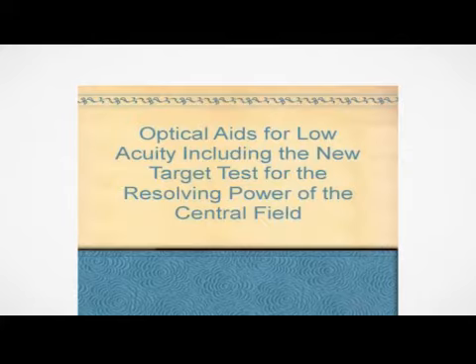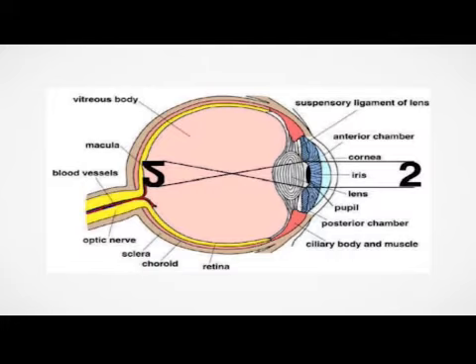Optical aids can greatly benefit some students with low vision. It is important that low vision aids are prescribed by qualified eye care practitioners. One optical aid cannot fulfill all low vision needs, and students should be assisted by trained personnel to experiment with a range of prescribed aids to evaluate their suitability for each task. These aids will not result in normal vision, but will help the student gain maximum visual functioning.